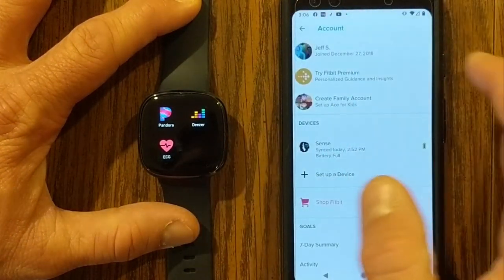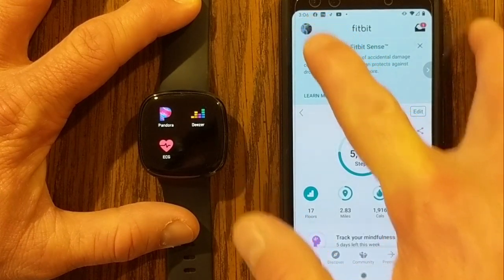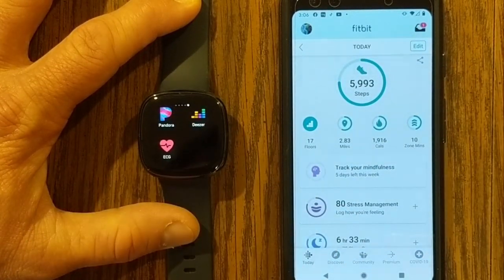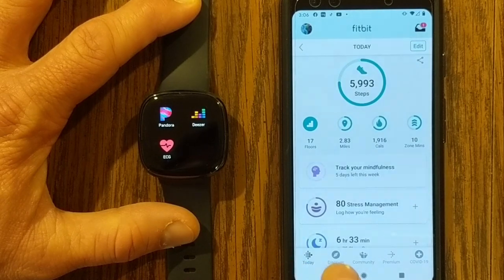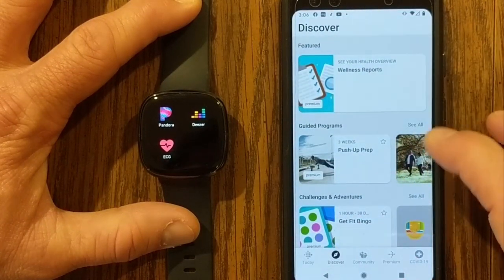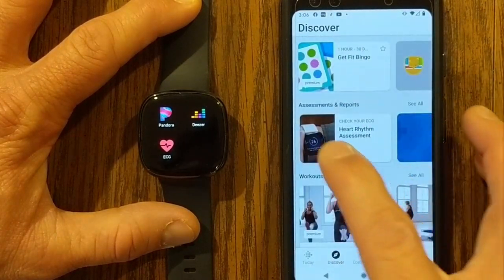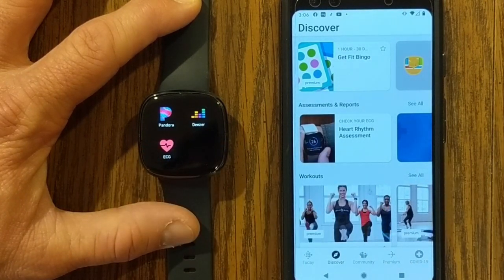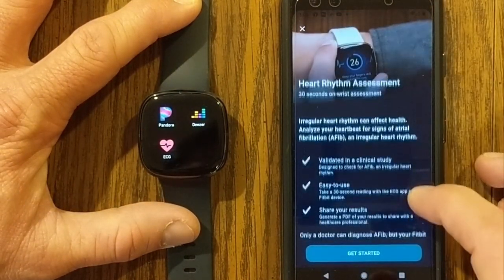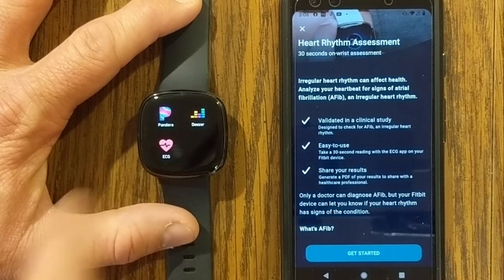We can go back to my main dashboard. If you scroll down, you can get stats for all sorts of different readings and senses. Right now we're under Fitbit Today. If you go to Discover and scroll down, you'll see different areas: featured, guided programs, challenges, adventures, and then assessments and reports. Under assessments and reports, you'll see it says 'Check your ECG — your heart rhythm assessment.' If we click on that, this gives you a whole area talking about the 30-second assessment we're going to do in the ECG app.